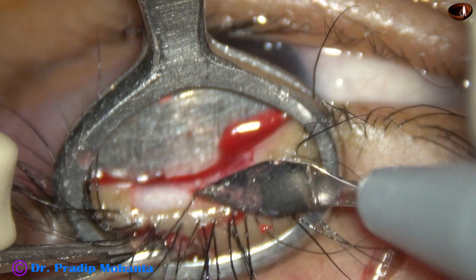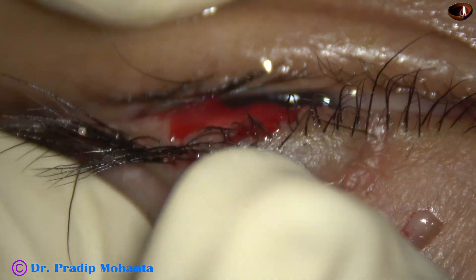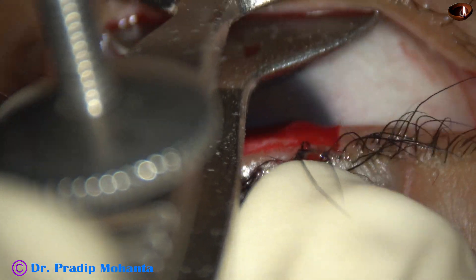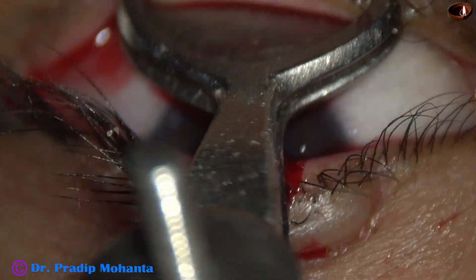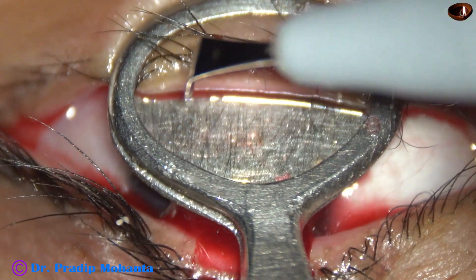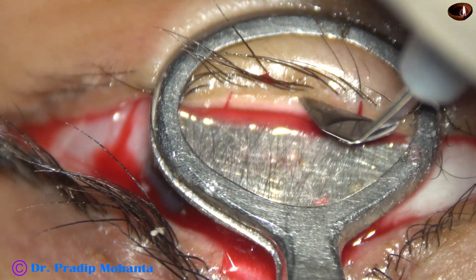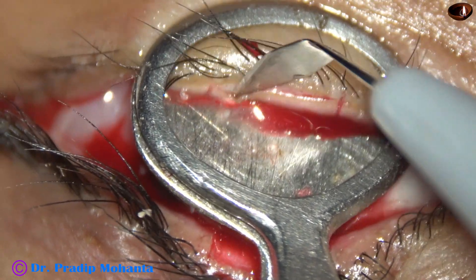Now the chalazion forceps is removed and we decide where to place it. Exactly opposite, we place the chalazion forceps — the solid side goes under the eyelid and the open side is above the eyelid — and we take guidance of the cut area in the upper lid and just cut the tissue.